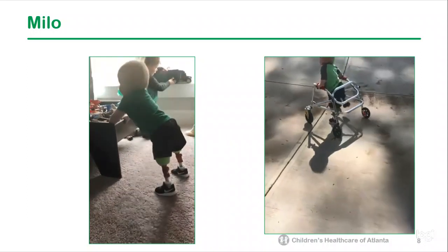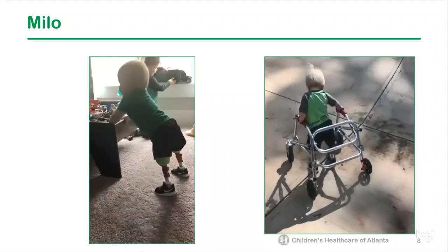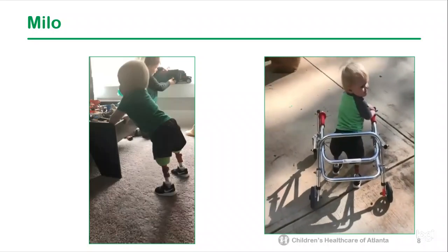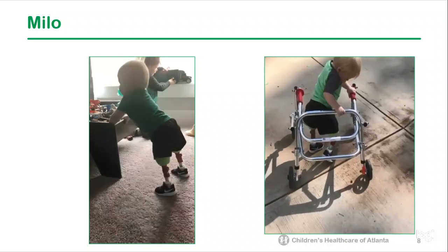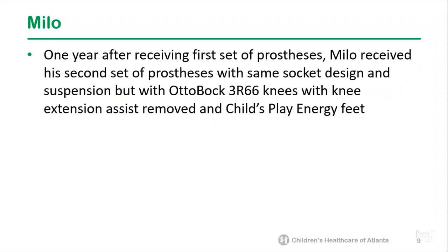He received PT at our center and also at home with a community provider who partnered closely with Colleen Coulter, his PT at Children's. He began using a walker about a month to 6 weeks after receiving his first prostheses. Milo is now 2 years and 3 months of age and has been walking independently for 2 months.